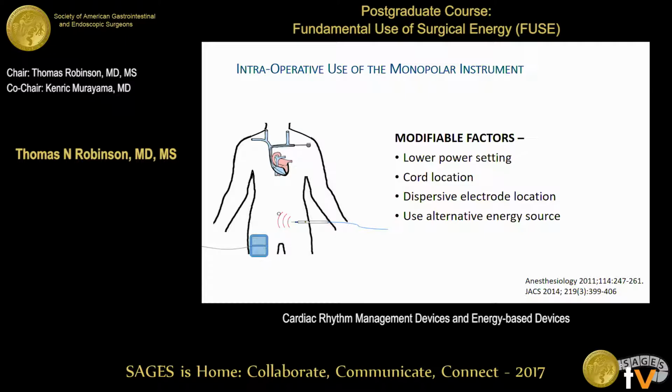Yeah. Tell me again why I can't live with a knee jerk. I put a magnet on every case. Tell me again why that's not the right answer. Okay, poor Mark would roll over. So the electrophysiologists do not want you to just use a magnet in every single case.